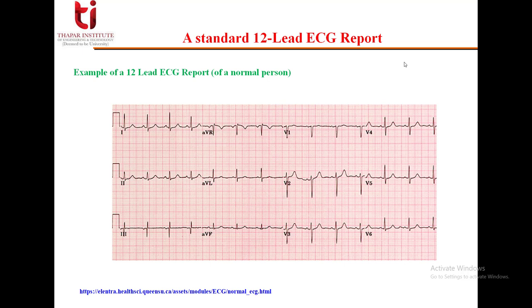A standard 12-lead ECG report shows a 2.5-second tracing of each of the 12 leads. These tracings are most commonly arranged in a grid of 4 columns: the first column shows leads 1, 2, 3; the second shows AVR, AVL, AVF; the third shows V1, V2, V3; and the fourth shows V4, V5, V6.